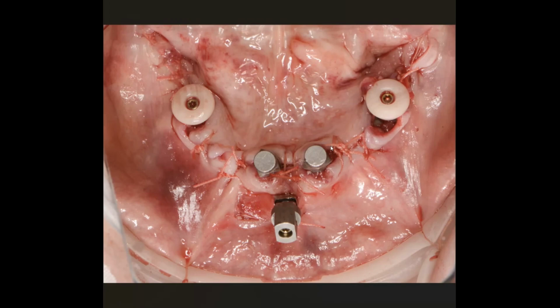prosthesis itself to dictate. Talking a little bit about that, this is where you're ready to do your scan, your alignment scan, your fiducial scan. A lot of people will call this the soft tissue scan, the tissue scan, right? Now, tissue scan is one benefit, one aspect of one goal of what you're trying to capture.